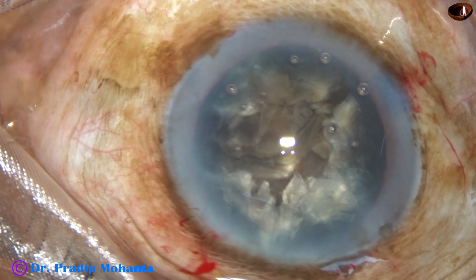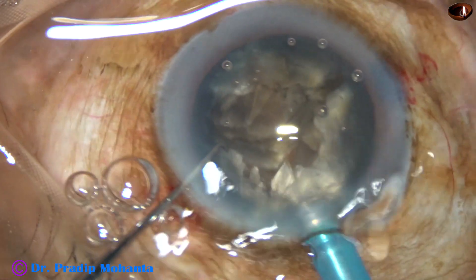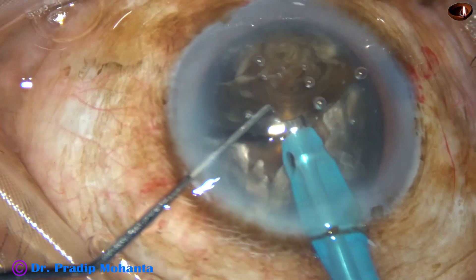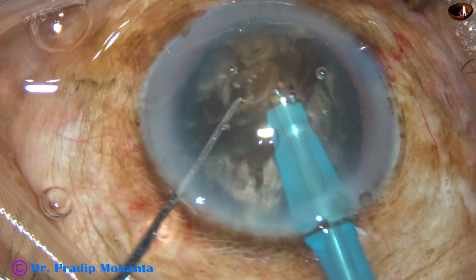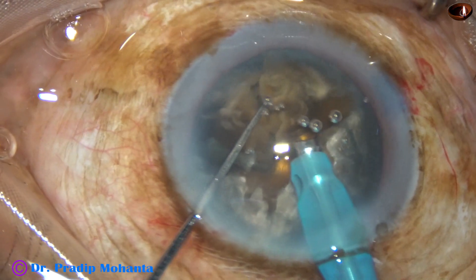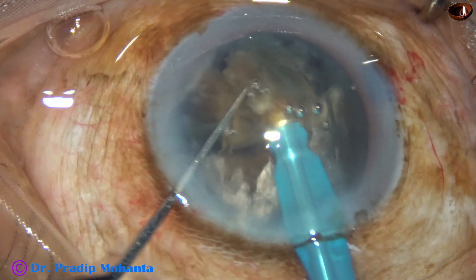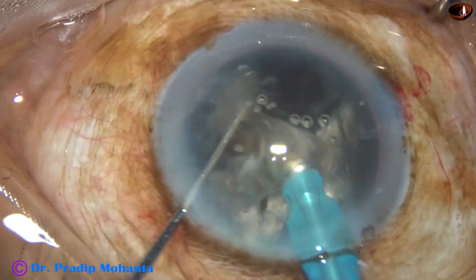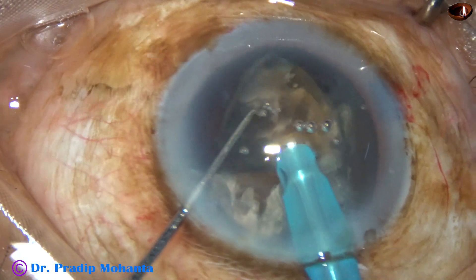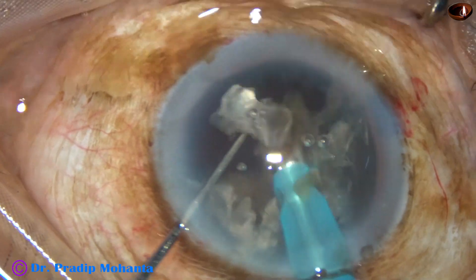I inject viscoelastic again and decrease the exposed part of the tip because I am going to emulsify the fragments now — I don't need much ultrasonic energy at this time. From the very beginning, I am using 450 vacuum, 45 flow rate, and 85% ultrasonic energy. The ultrasound is in continuous mode, but I am using the ultrasound intermittently, not continuously.